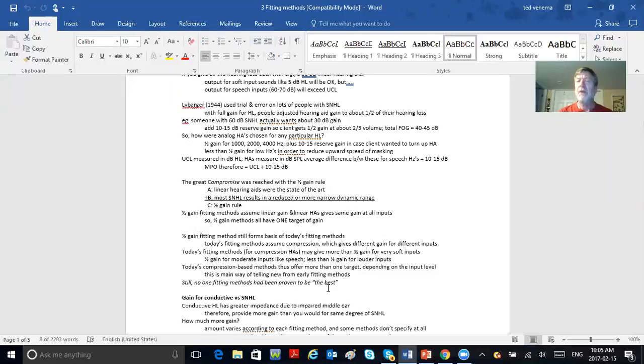You hear? And the guy invariably would turn it down by about half. That's where he figured out the half gain rule. For example, somebody with a 60 dB sensory neural loss actually wants about 30 dB of gain. And then he would supply the person with a linear hearing aid that gave about 30 dB of gain, and then he'd add about 15 dB reserve gain so the guy could crank it up a little bit louder if he felt like it.